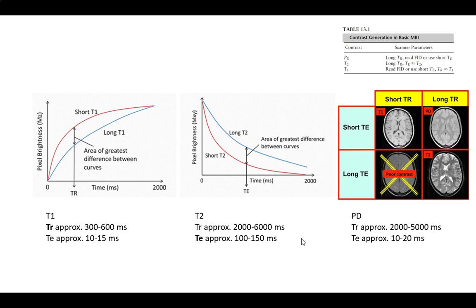Okay. So let's say, for instance, the doctor says, I'm suspecting that there's some type of an edema under the skin, whatever else. From that, they're going to select what they're interested in. Okay, I really care about a fluid differential on my T2. Or, I'm looking for a tumor in the white matter of somebody's brain. I want a PD for it.